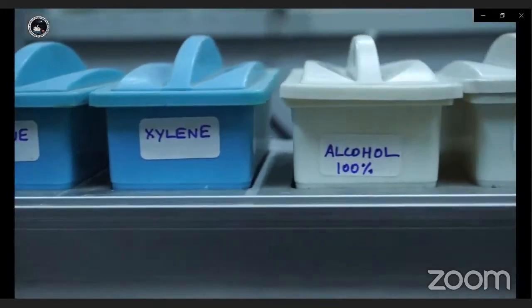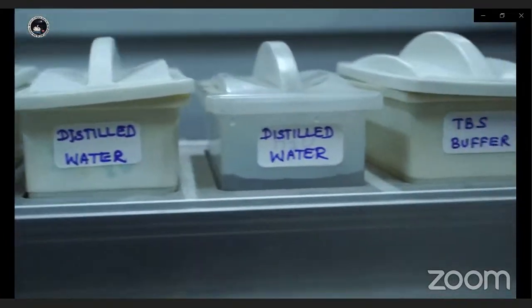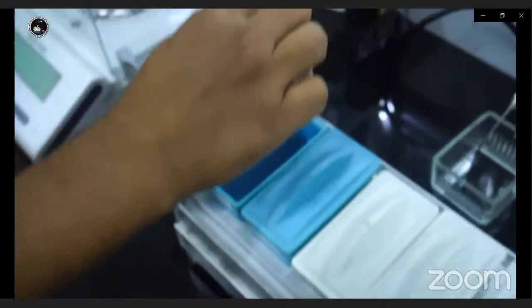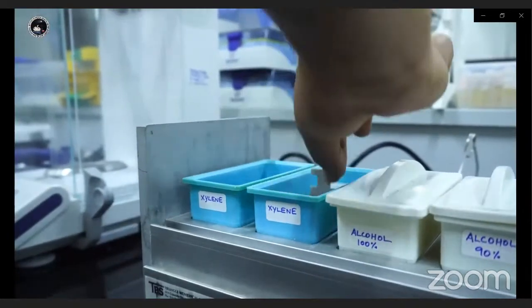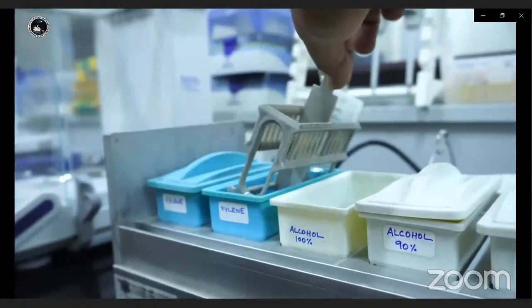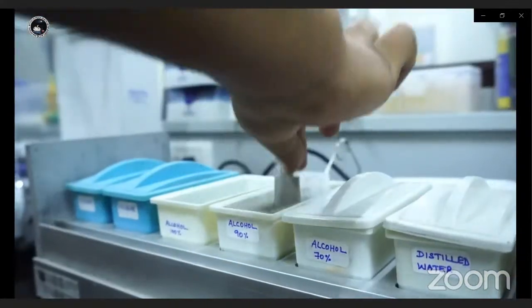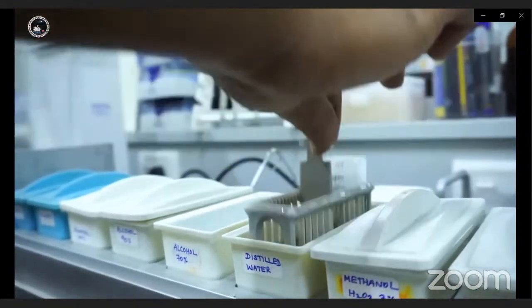We have arranged the reagents in the order required for staining. The first step is deparaffinization. Place the slides in xylene for dewaxing for 5 minutes, 2 changes each. This is followed by rehydration in graded alcohol from 100%, 90%, 70% and distilled water for 3 minutes each.